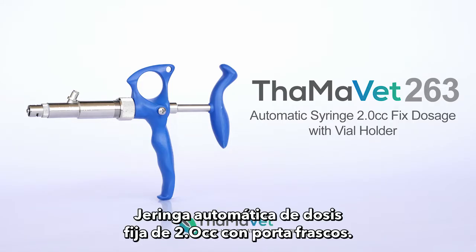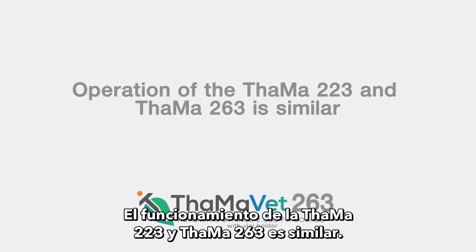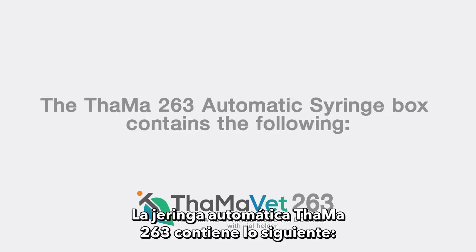TAMA 263 automatic syringe, 2.0 cc fixed dosage with vial holder. Operation of the TAMA 223 and TAMA 263 is similar. This video will feature the TAMA 263.